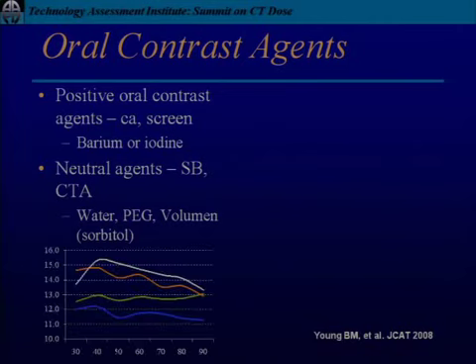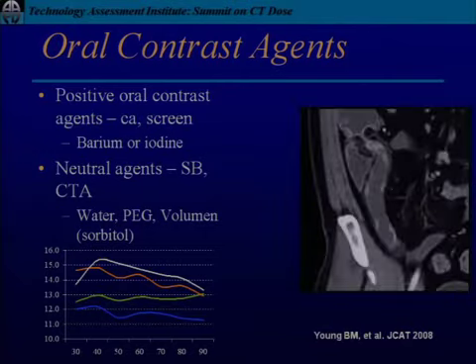This is a graph showing different oral contrast agents, the diameter of the bowel over time, and the blue is water. So if you're giving water, you should know that it's going to be resorbed over the small bowel over time, so you're going to want to use probably another agent if you're looking at the ileum. Okay, because this is what we really want to see in Crohn's disease, for example. This segmental patchy hyperenhancement that you see in this terminal ileum is pathognomonic for Crohn's disease.